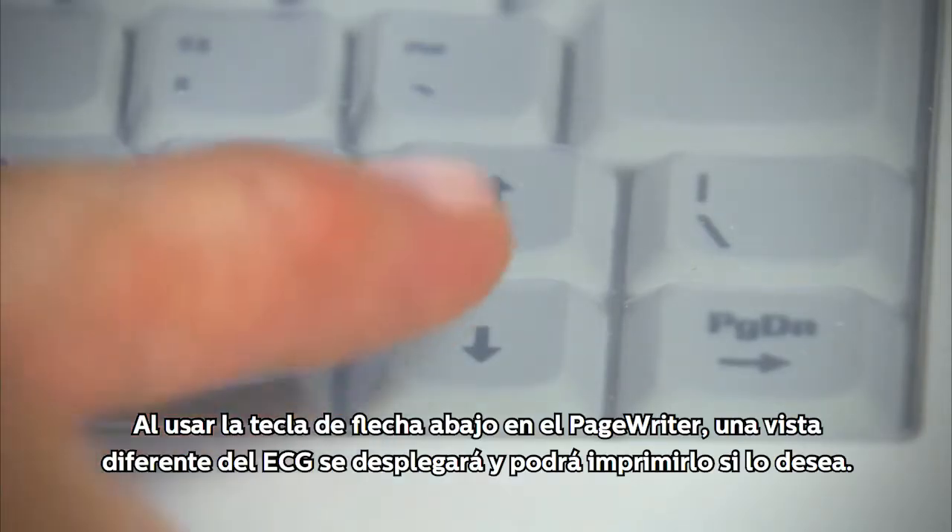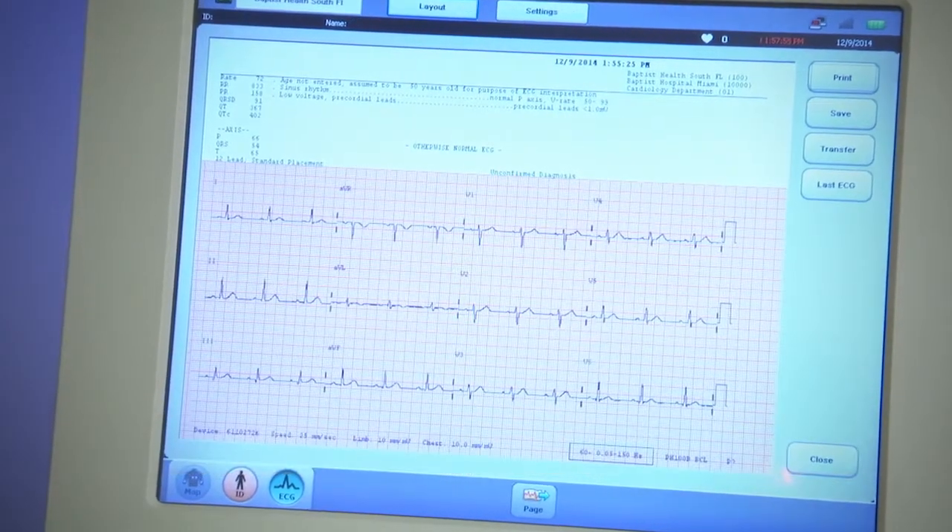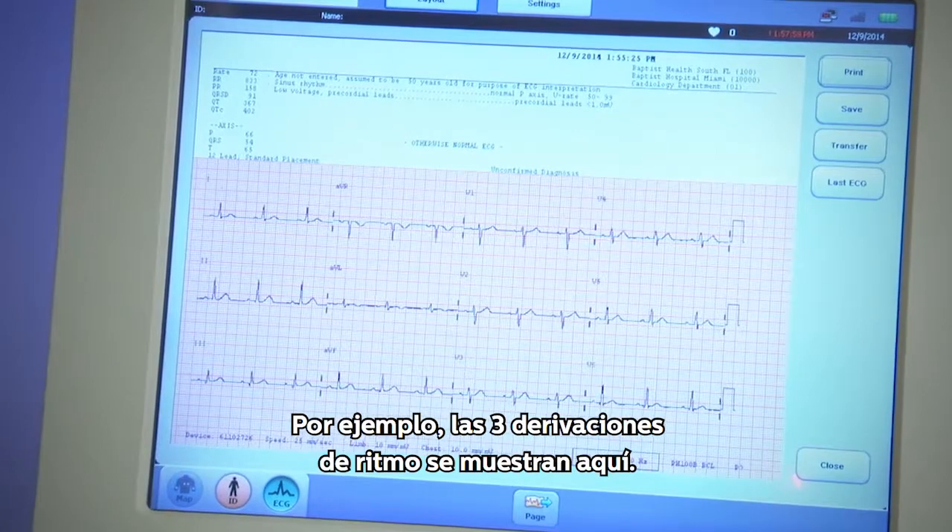Using the down arrow on the PageWriter, a different view of the ECG may be seen and printed if desired. For example, the 3 rhythm leads are shown here.